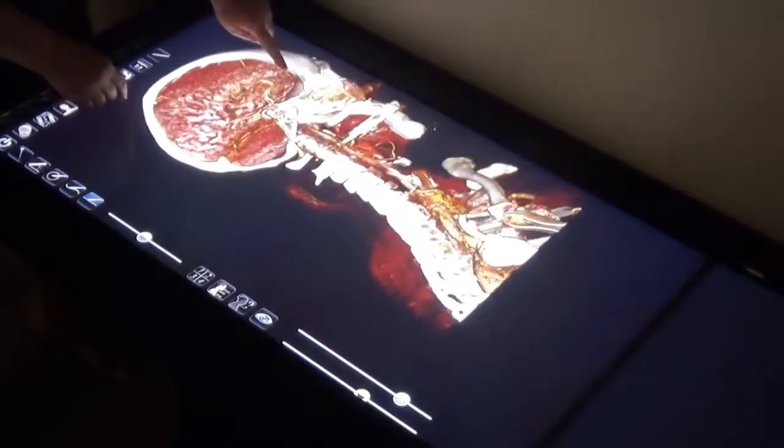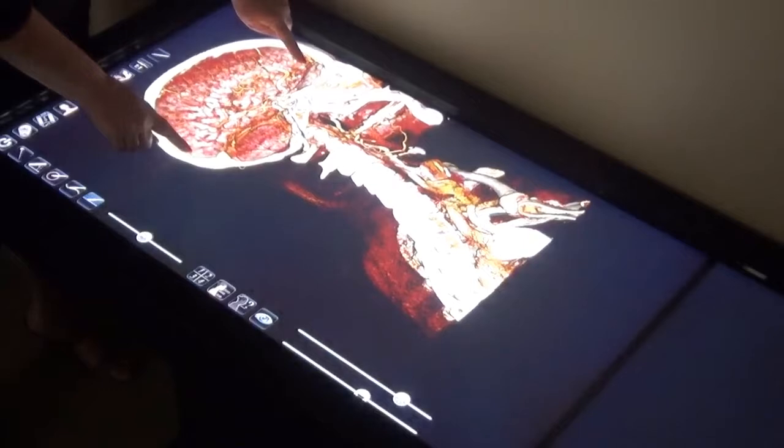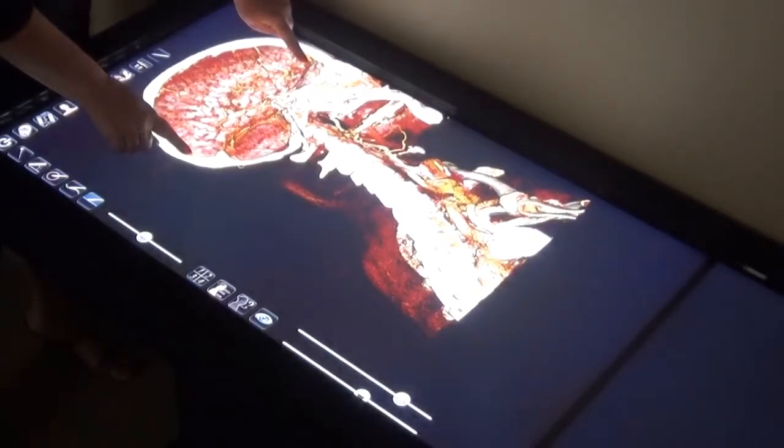Dissections can be made along the median, frontal, parasagittal, and transverse planes in varying layers.